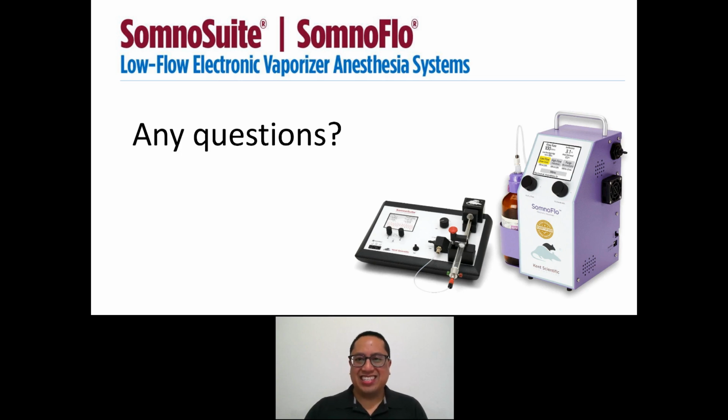So the first question on my list here is, when ambient air is used rather than compressed oxygen, are there any physiological effects? Is recovery time affected? All right, thank you, Sean. Hi, Sean. Nice to meet you. So when ambient air is used rather than compressed oxygen, are there any physiological effects? To my knowledge, there are no physiological effects or any differences between using ambient air and compressed oxygen.